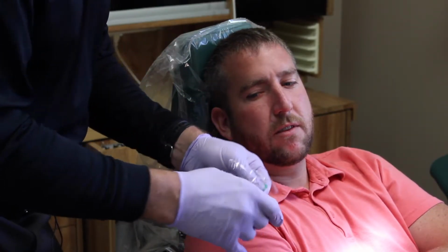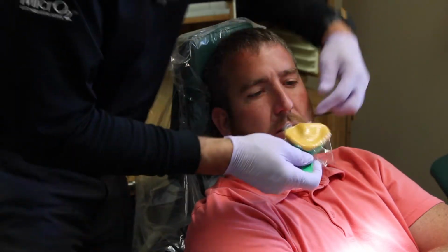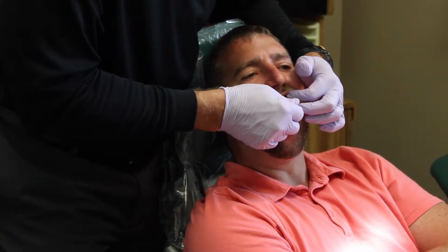Why? Well, because first we take an impression to make a custom tray in a sense, because we use a heavy body putty material. This is a Kettenbach material, and we're going to fill the tray, and then we're going to put a separating medium over the top, use that as a first wash impression, then put a light body wash on it. So it's 2 setup times. I'll be right back. So what I've done here is I filled the tray, and then I've put some saran wrap. You can use handy wrap, you can use Costco brand, anything like that. And we're going to take an upper impression using that as just a tray material. Seat that fully, making sure you see it extend up around the teeth beautifully.